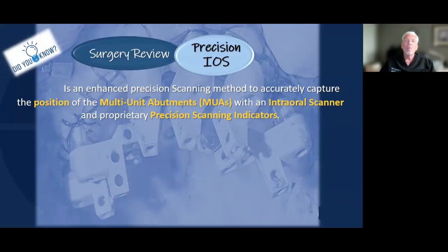And really, what that is, is that you have scan bodies that have been very precisely designed, and a little different than your single unit scan bodies for crown and bridge cases, because it's not recommended at all to use a single tooth or a crown and bridge type of scan body when you're getting into the multi units for a full arch case to capture all your data.